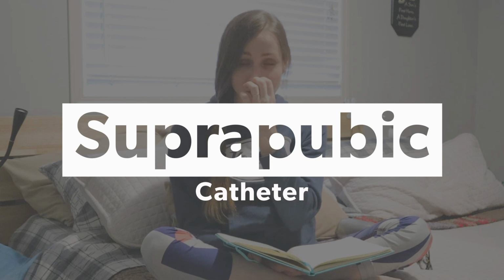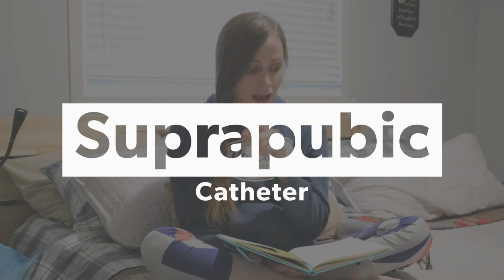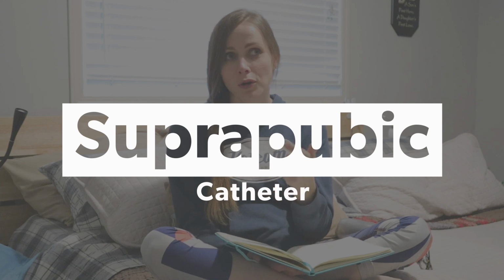Way number 2. Moving on to number 3 is a suprapubic catheter, and a suprapubic catheter is a catheter that is inserted into your bladder through a cut that they make in your lower abdomen, below your belly button or somewhere around there. And it is done using local anesthetic. Usually you just go into a urologist's office, they make the insertion, put the tube in, and then they leave it in there. And as long as the tube stays in there, it doesn't heal over.